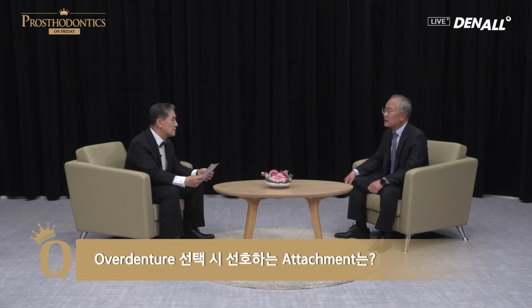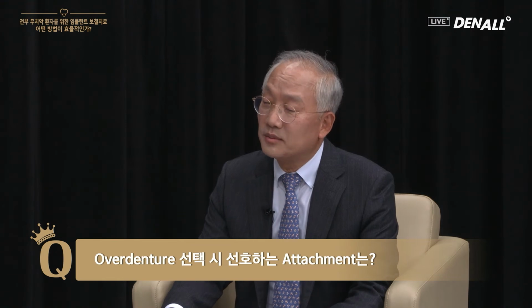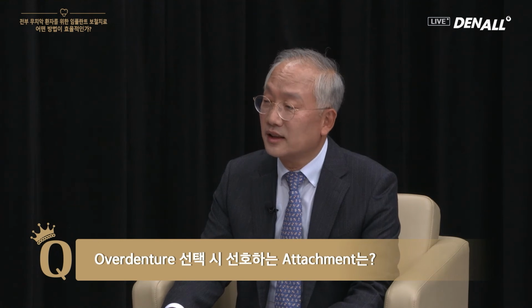Second question. In the case of implant retained overdenture, what kind of attachments do you use and prefer to maintain the implant? I refer to a lot of literature and I just follow what the paper tells me to do. In the case of maxilla, I prefer bar over denture, and in the case of lower, I use 2 implants and separate it like this. O-ring or locator are used.